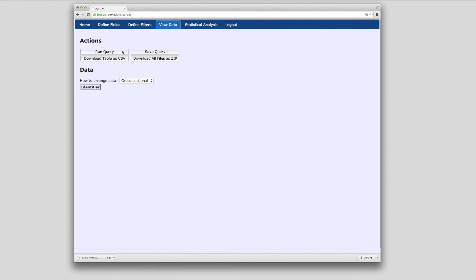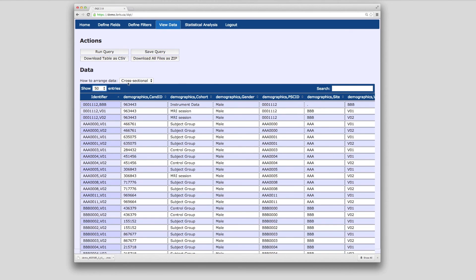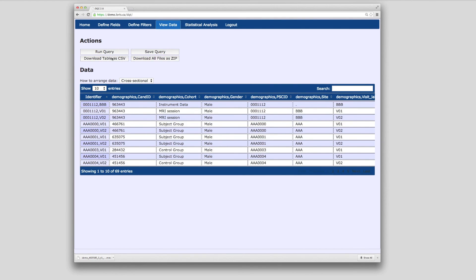By default, the results will be displayed cross-sectionally with one row per time point. Queries can also be run longitudinally, displaying data from all visits in a single row. Click on Download Table as CSV to download the query results to your desktop.